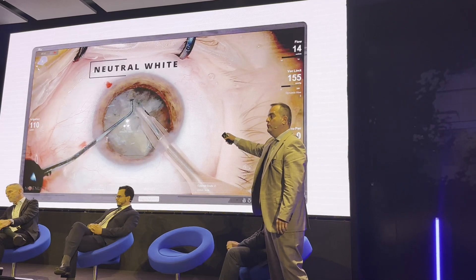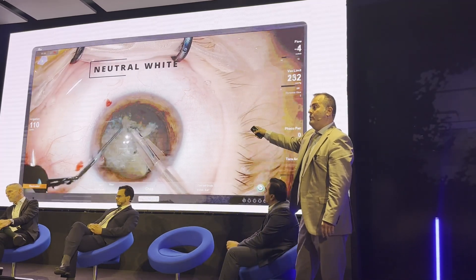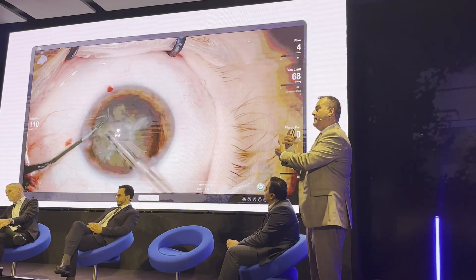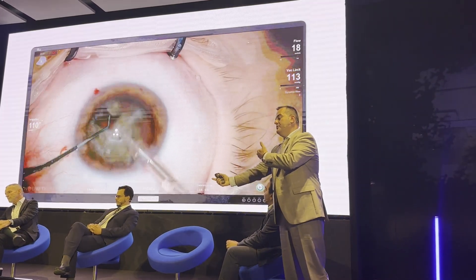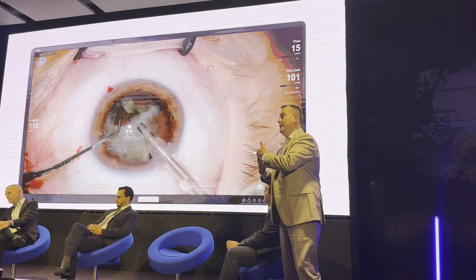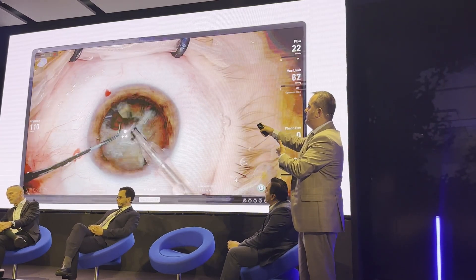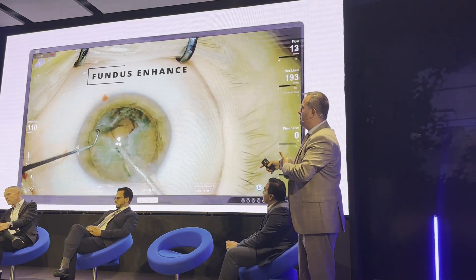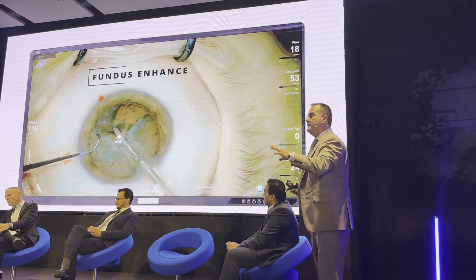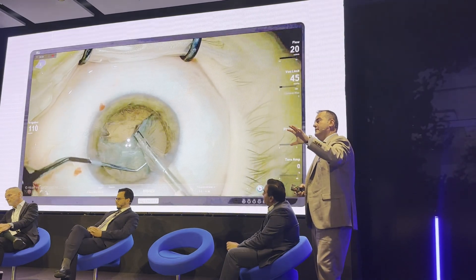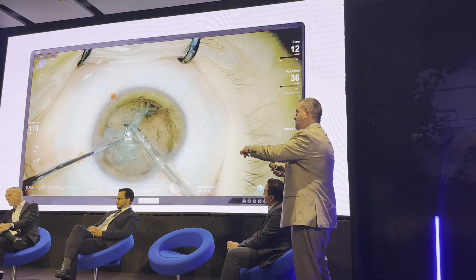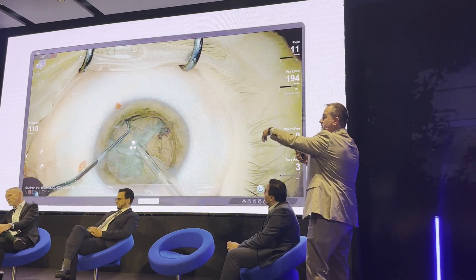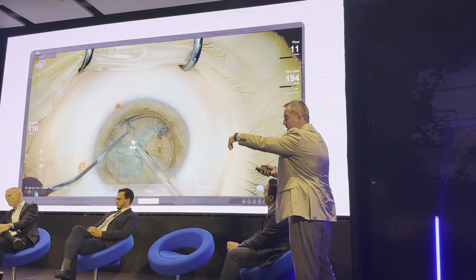The yellow wavelength at 577 penetrates the pieces better. When we chop the pieces, we lose the fundus reflex — why? Because the reflection is blocked. So we need to cleverly pick the wavelength which is most reflected, in order to enhance perception of the fundus reflex. Here you can see that we have sort of preserved piece transparency, so we can chop safely, and when we pick behind the piece, we can see where we are going.